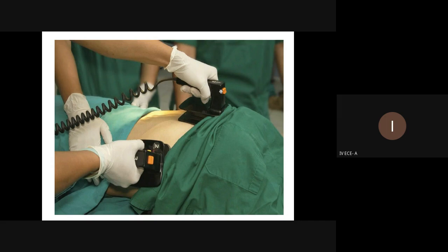So this is very important, because whenever we are pressing, only then is the voltage supplied. Otherwise the paddle is in an idle state, and there is no voltage supply.